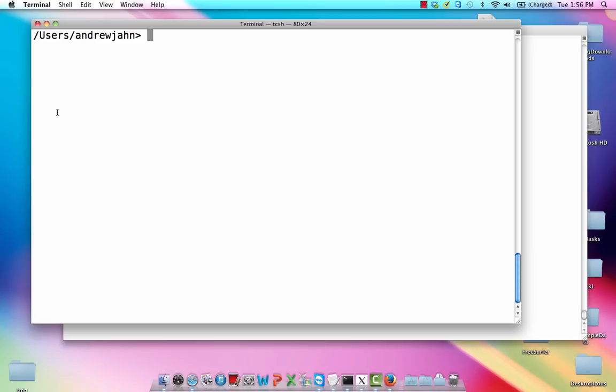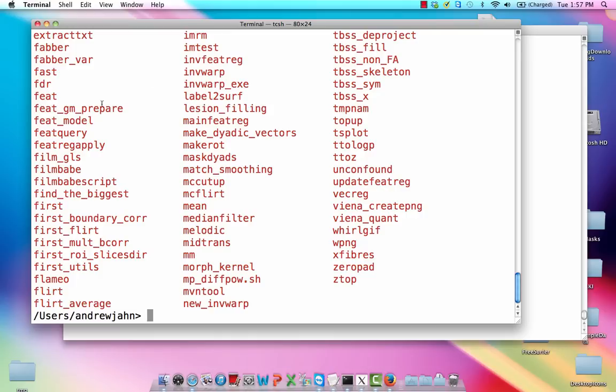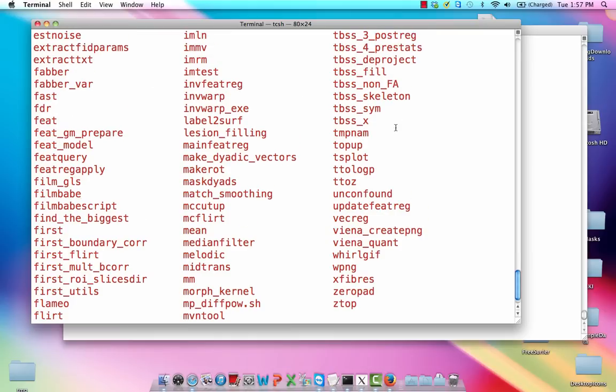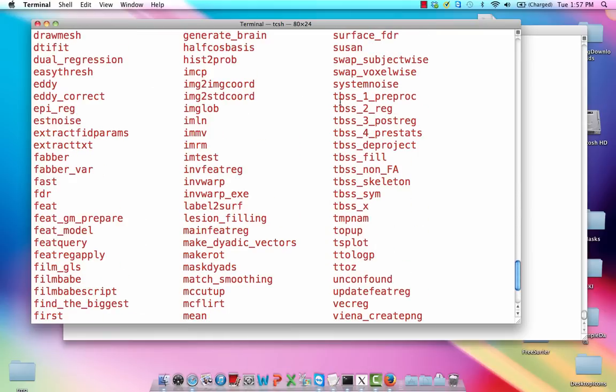And while that's going, I would just like to show you where all this stuff is in the FSL directory binaries subdirectory. So all these commands with this TBSS, those are pretty much all that's going to be called upon after we have our FA images and we're trying to prepare it for entry into the GLM. So the ones that I'm going to be using here are 1, 2, 3, and 4.